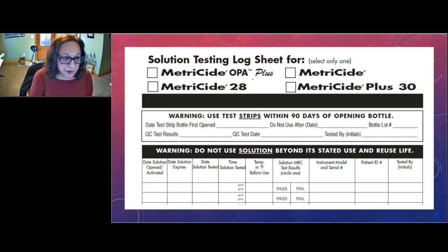Plus the fact that with steam sterilization or dry heat sterilization or chemical vapor sterilization, you have a way to monitor the sterilization process that is much more reliable than the test strips that you're using for cold chemical sterilization. I'll reiterate it again. If you can get around it and not do cold chemical sterilization, don't do it.